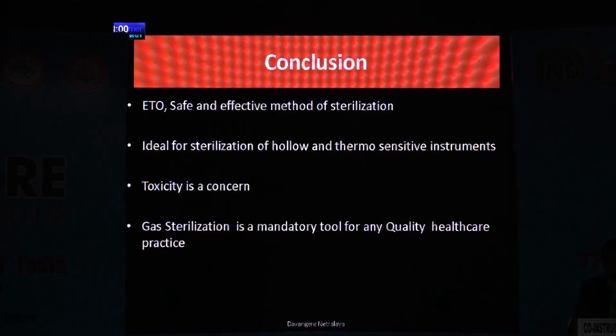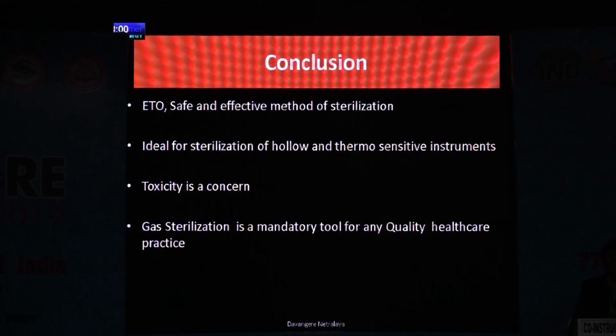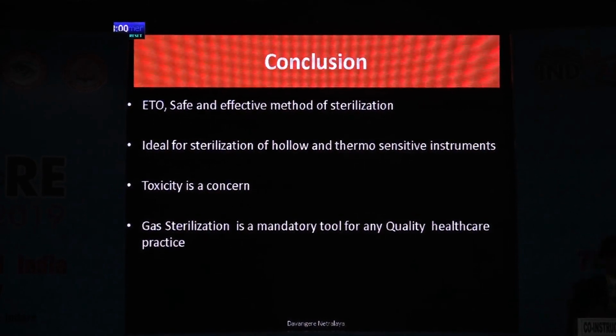So in conclusion, it is a safe and effective method of sterilization, ideally useful for, I won't suggest hollow alone, but it's mainly for the thermosensitive products. And toxicity is a concern. Gas sterilization is a mandatory tool for a quality healthcare practice. You cannot say that, I got an autoclave, somehow I'll manage without having an ETO. But definitely ETO is a very essential tool for the day-to-day quality healthcare practice.